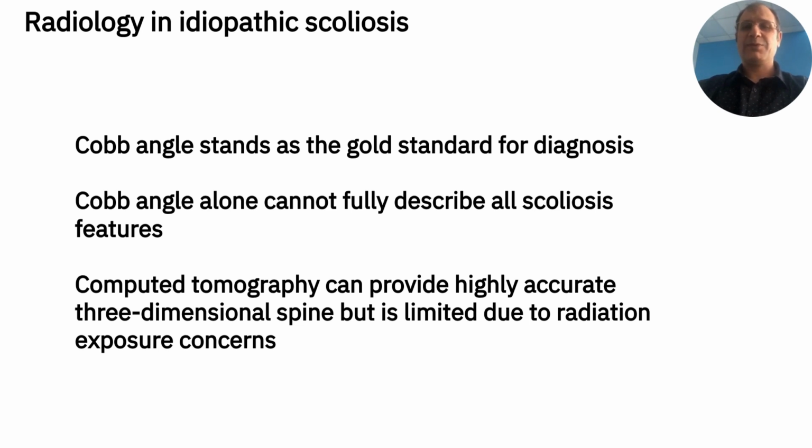While computed tomography can provide highly accurate three-dimensional spine reconstructions, its use for routine monitoring is limited due to radiation exposure concerns. As a result, standing postero-anterior full-length spine X-rays remain the primary imaging method for diagnosis and monitoring. Long-term outcomes in surgically treated cases depend not only on coronal correction, but also on the restoration of sagittal curves, highlighting the importance of comprehensive measurement approaches.